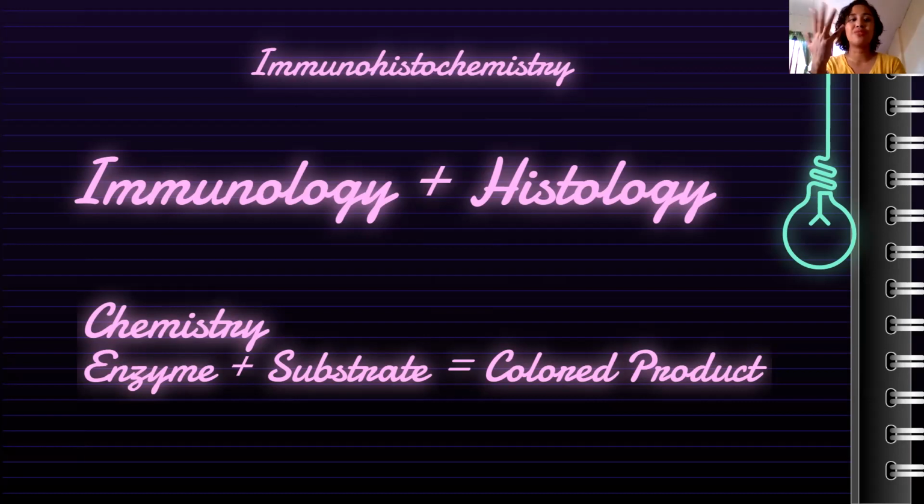Ma'am, isn't it that we have 5 types of antibodies? IgG, IgA, IgM, IgE, IgD. The antibody usually used as a reagent is IgG, immunoglobulin G. Apparently, class, when IgG combines with an antigen, sometimes the signal, the positive reaction or the aggregation, is too small.